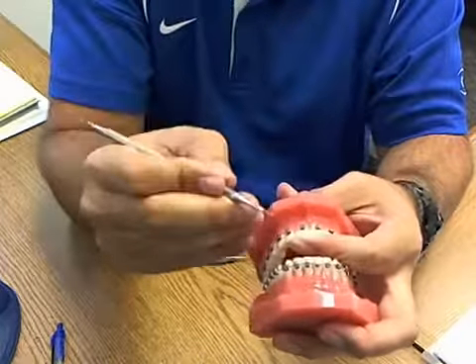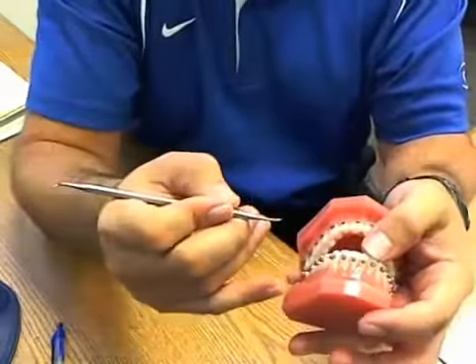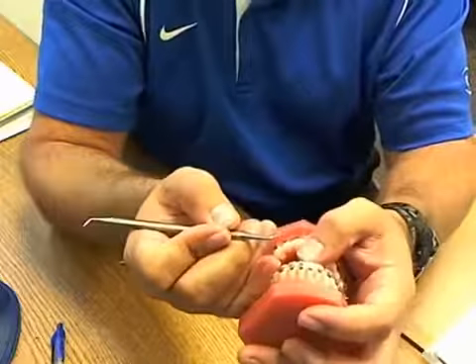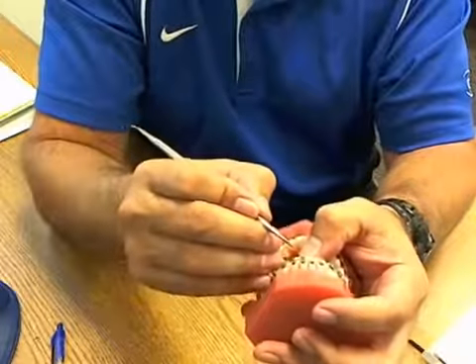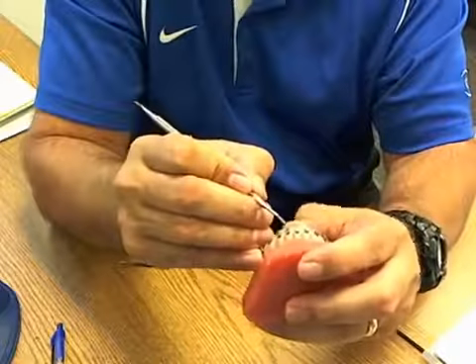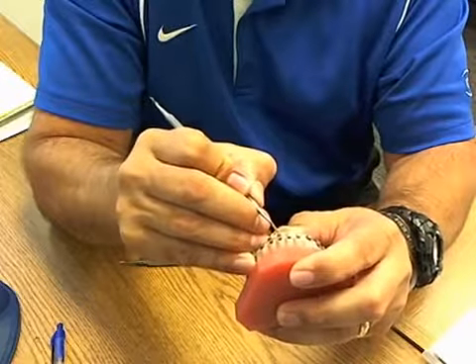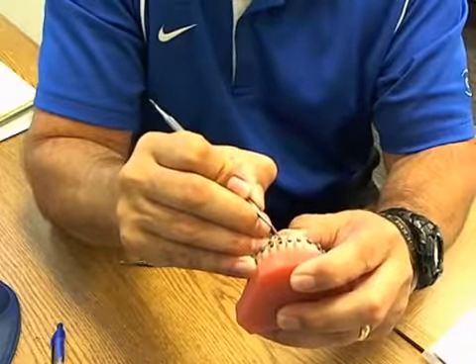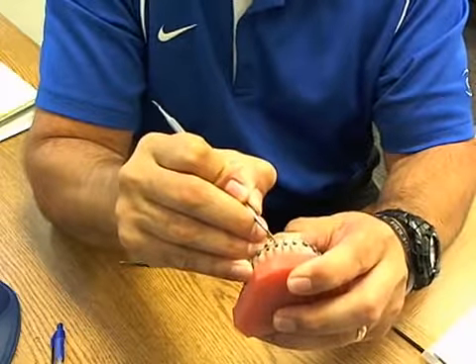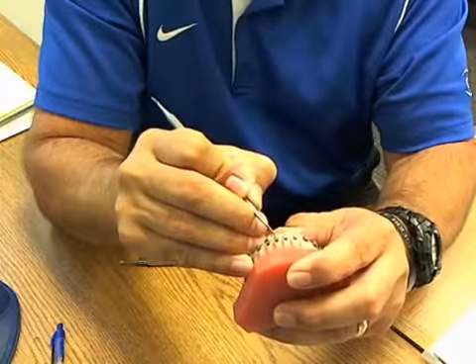Let them see what you're doing, go through a few more brackets, and talk to them about the lower arch. If the doctor or staff are sitting at a 10 o'clock position at chairside, the movement on the lower arch with Carrier SLX will be the same. Provide some support to the tooth, but this will be a pulling motion towards you. Pull in the open position on the lower anterior, then push to close and you'll hear it click. Very important to provide the support and enough of a downward force as you're pulling.